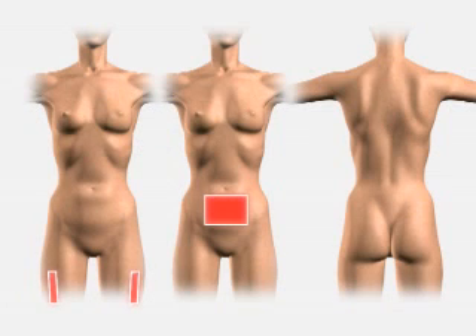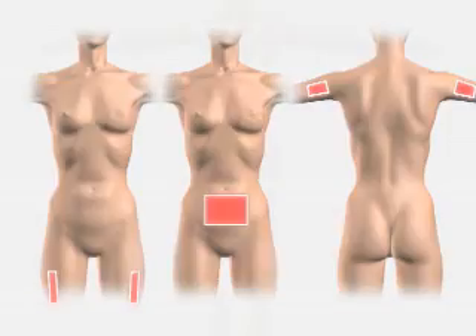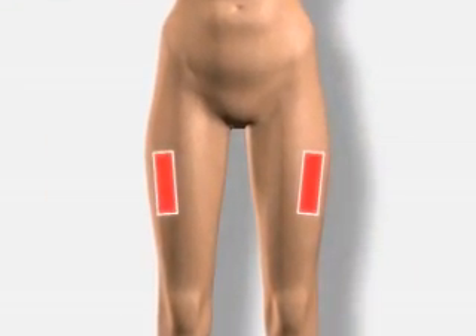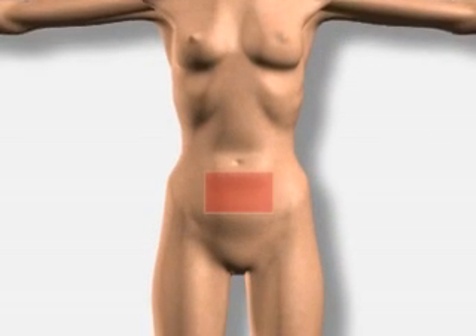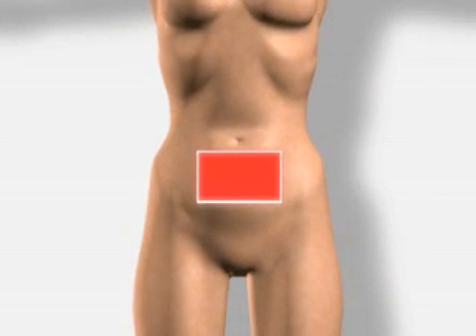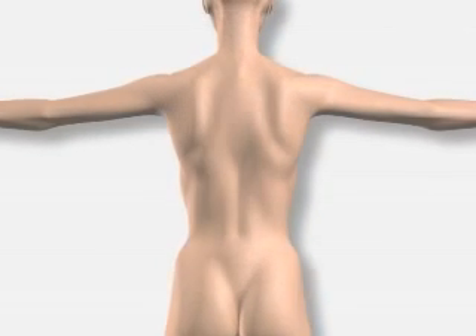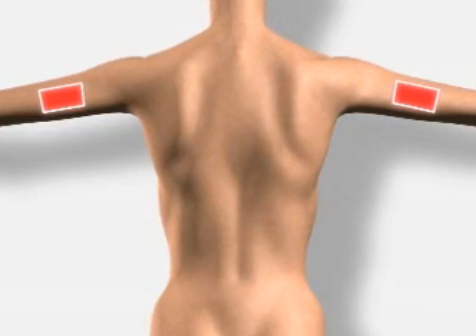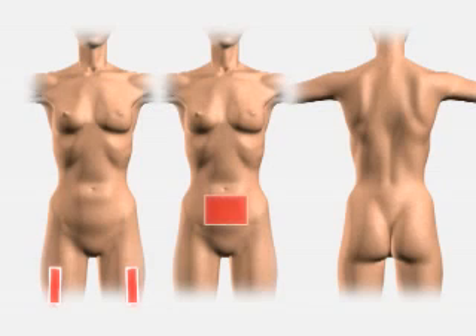Determine the subcutaneous injection site. These sites include the upper outer portion of your thighs, your abdomen staying approximately 2 inches to the right, left, or below your belly button, and the outer aspect of upper arms approximately 2 to 3 inches from your shoulder. Rotate your sites daily.